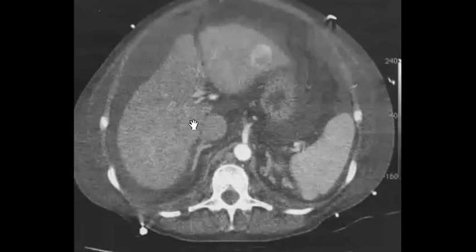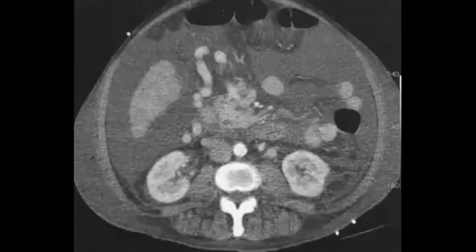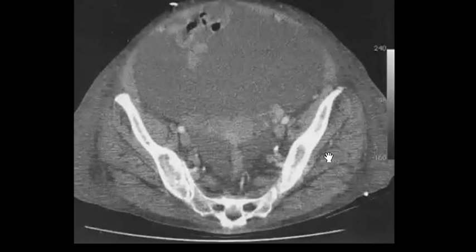So liver cirrhosis with a hepatic focal lesion, HCC will be the first possibility until proved otherwise. And it's important to mention whether this patient has ascites or not, whether he is compensated or not, complicated or not.